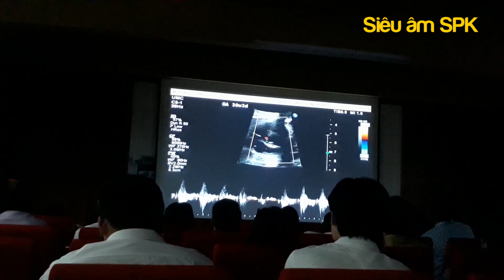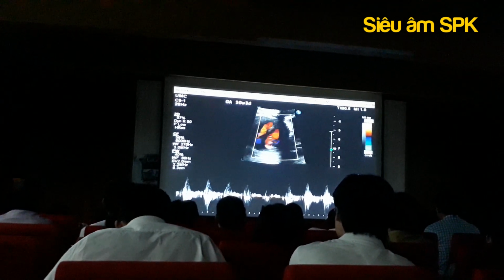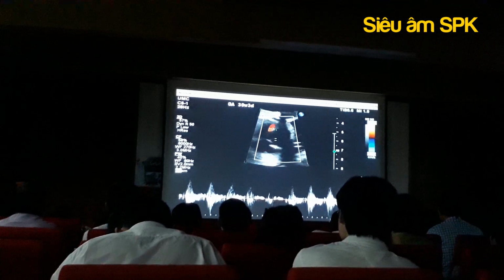Probably also normal. At higher heart rates, fusion of the E and A waves can be normal.